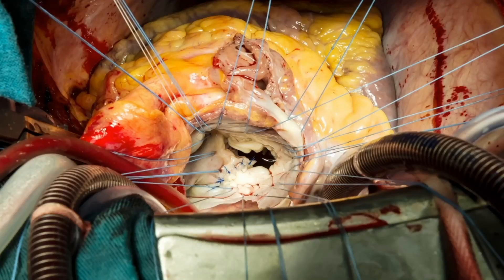The mitral valve, seen here from a surgical perspective, is a complicated structure and comprises not just the mitral valve leaflets but also the annulus, the chordae tendineae and the papillary muscles.